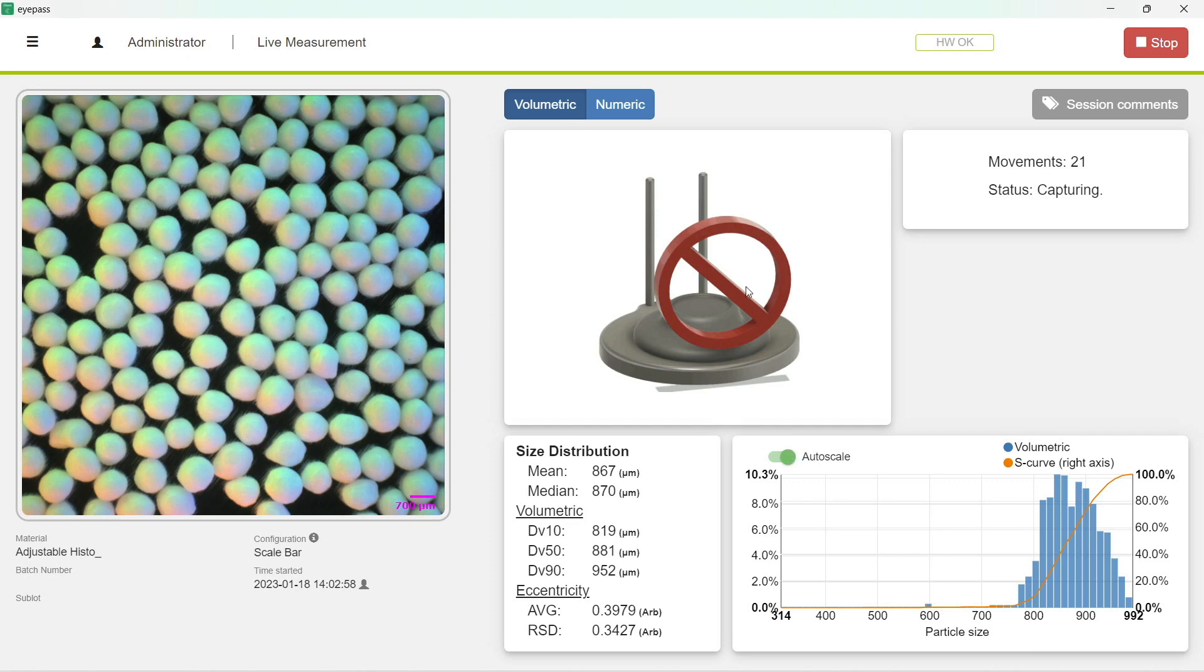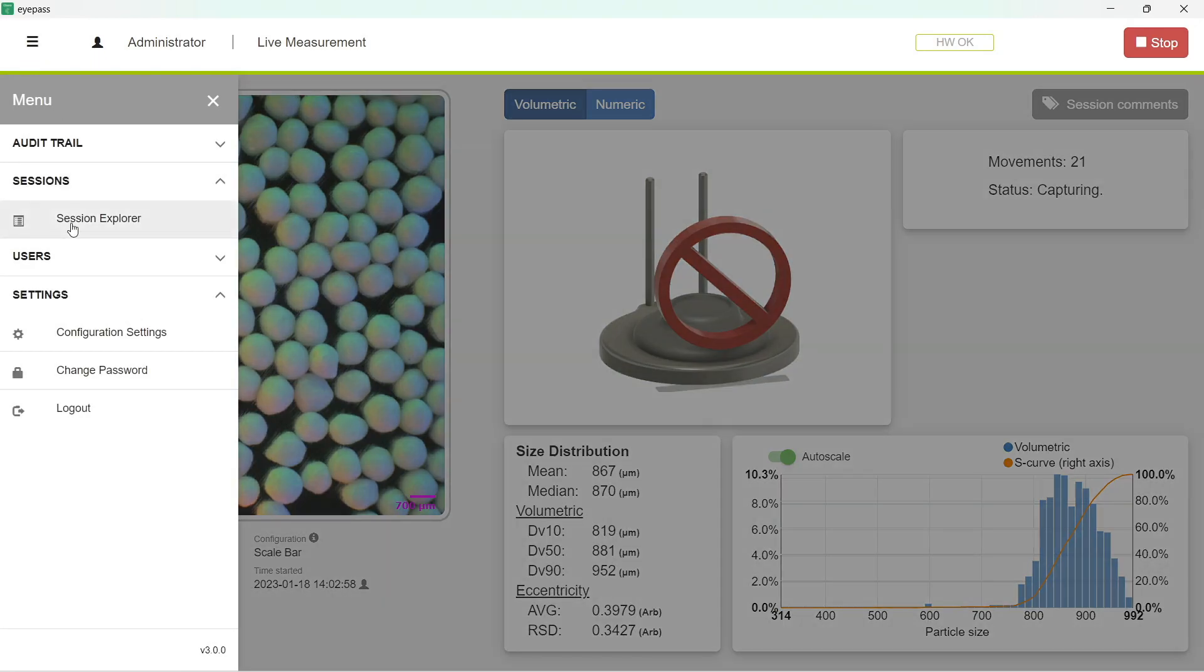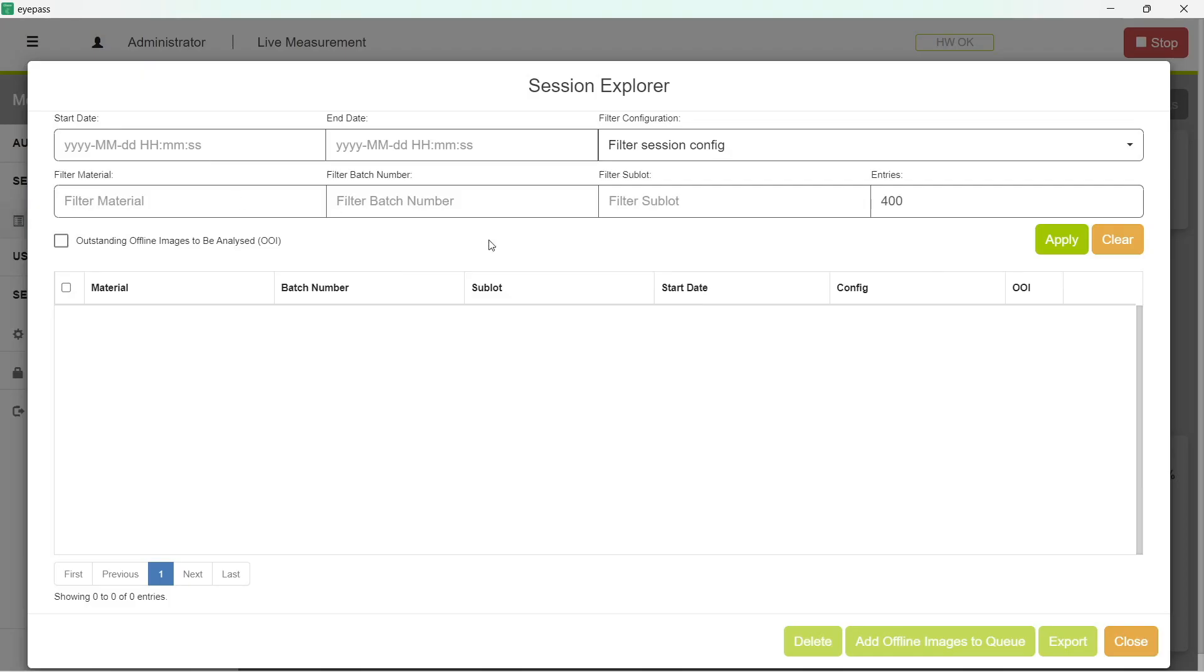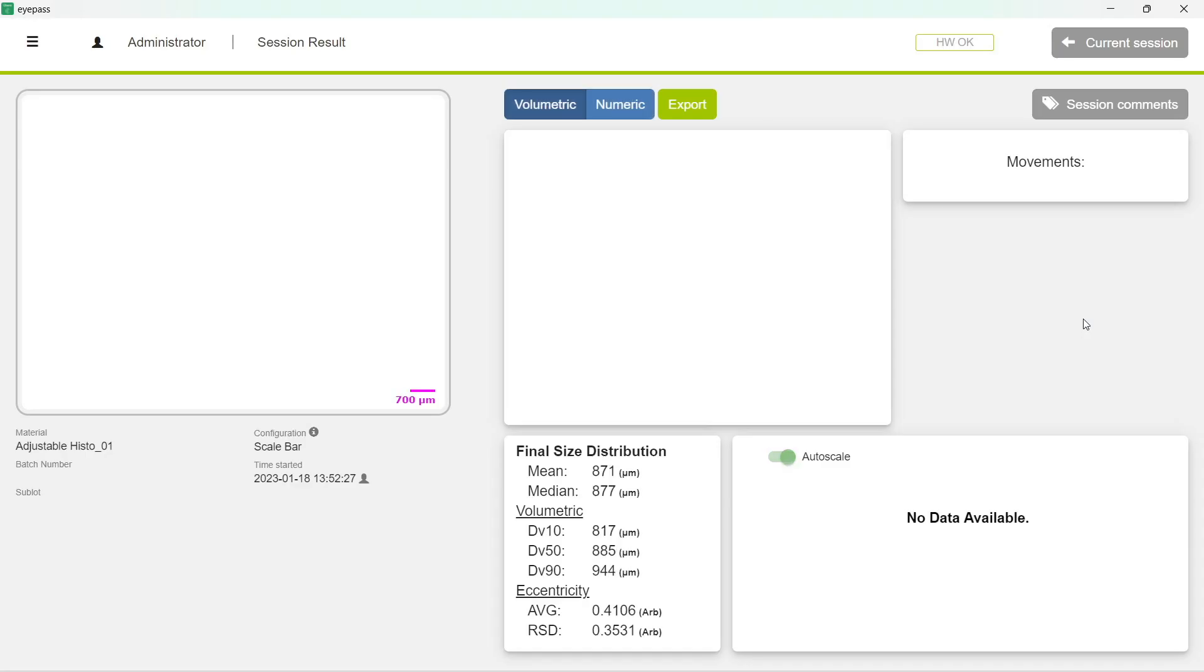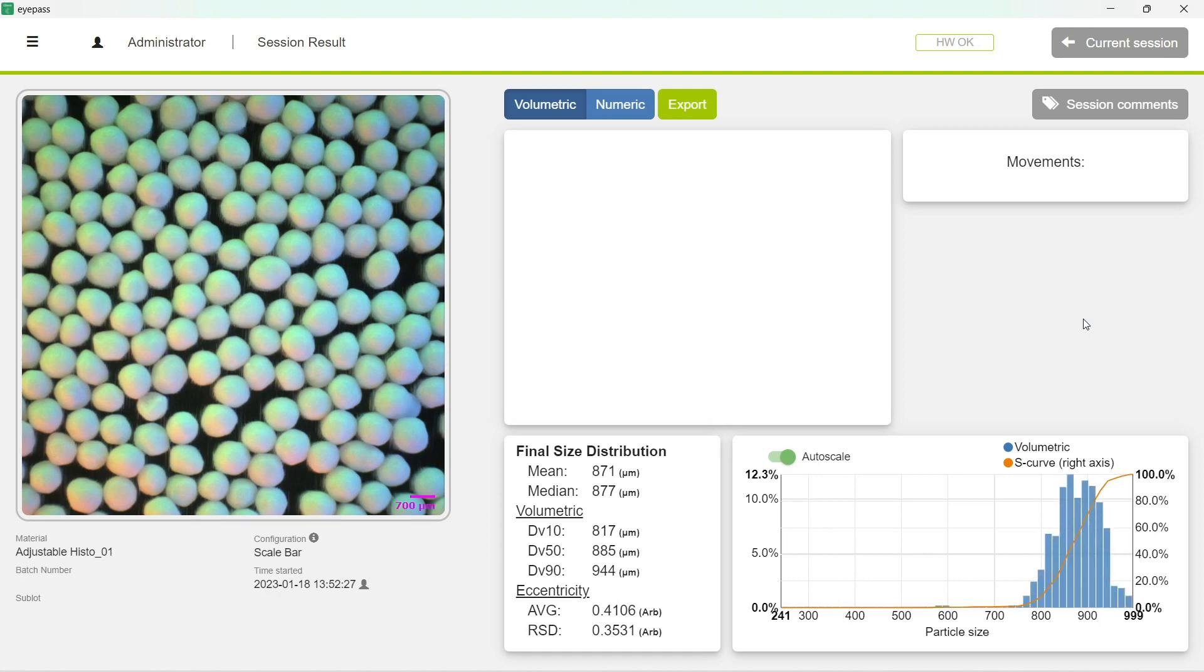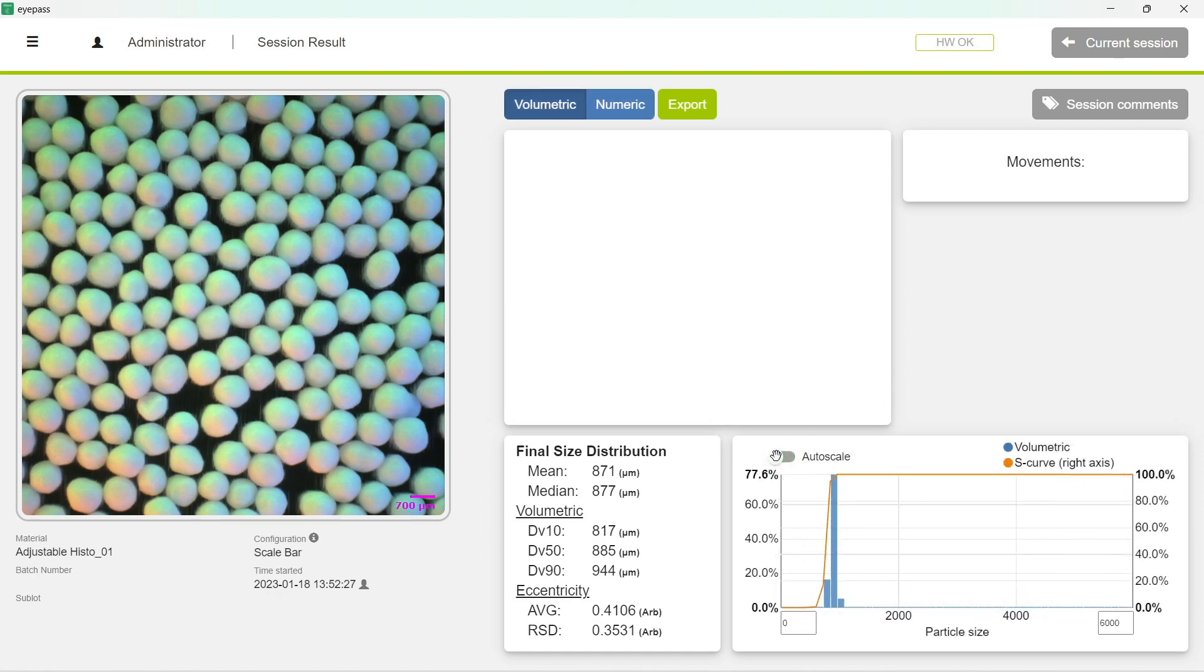We can do this both in real time and when we recall a session. So going back to Session Explorer and opening a recently run session, you can turn auto scale on and off.